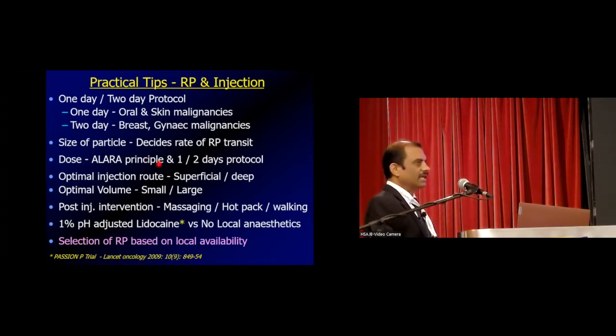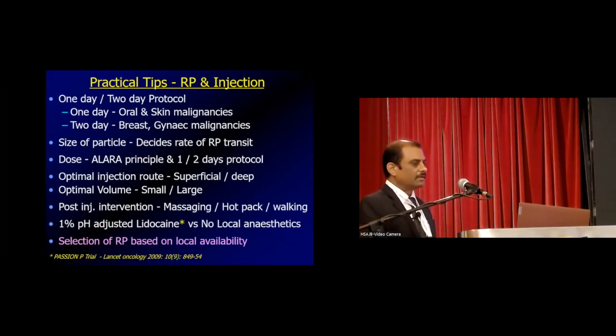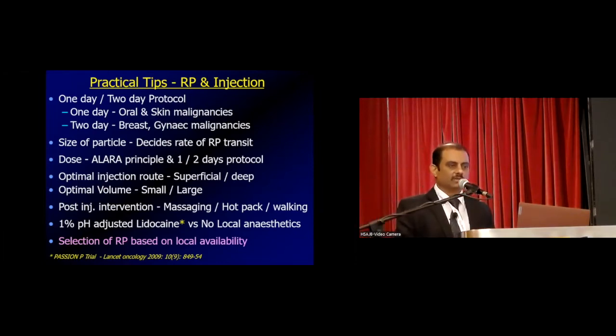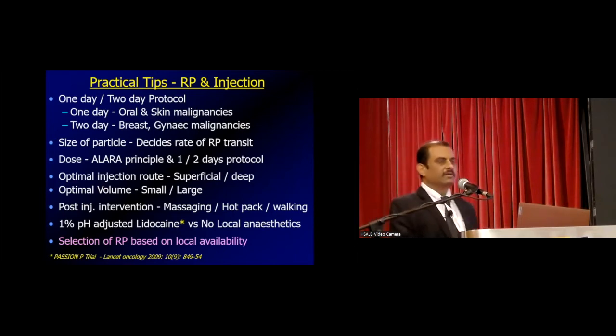producing radiopharmaceutical as possible. Majority of the time we use only microcuries, and we don't really need to give any local anesthetics. It has been proved that local anesthetics can impair the movement of the lymphatic particles, so we don't use any local anesthesia in the injection of the radiopharmaceuticals for the sentinel node image. The selection of radiopharmaceutical, as I told, filtered sulfur colloid or nanocolloids.